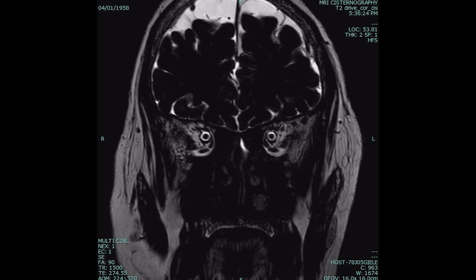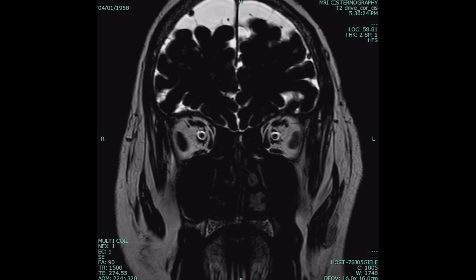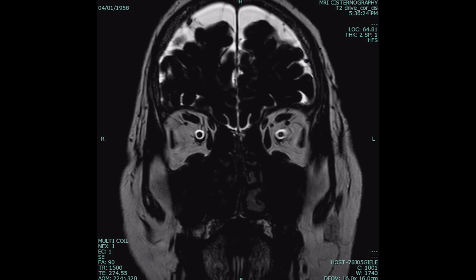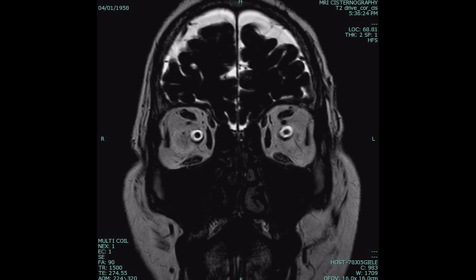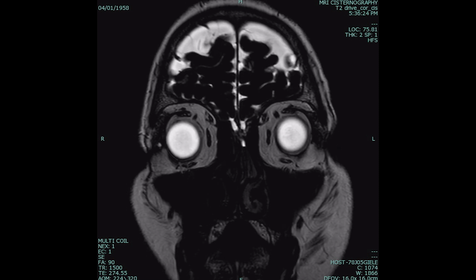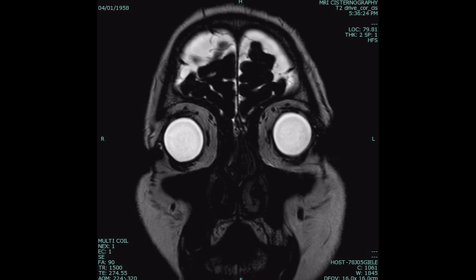So these scans are taken in both prone and supine positions to be able to ascertain surely where the defect is from, because in these patients one has to have an open eye and mind, because there couldn't be more than one defect as well, and the defect could be on both sides even if the leak is happening on one side at this time. This defect is seen very clearly in the left side cribriform plate.